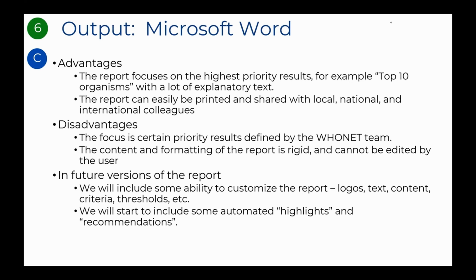There are also disadvantages. The focus is on certain priority results, so this report has less detail than what we saw in the Excel reports. The content and formatting of the Word report is defined by the WHONET team. If you wish to make changes to these reports, you must make these changes manually in Microsoft Word. To address some of these limitations, the WHONET team plans to make improvements in the Word reports in the future.